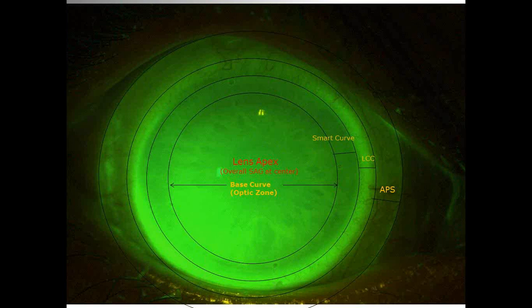And then we have our limbal clearance curve, which, as you see, should extend with fluorescein beyond the limbal area. And then that fairly broad landing area, which should provide good comfort, reduce the risk of compression and blanching and rebound redness and those sort of things.